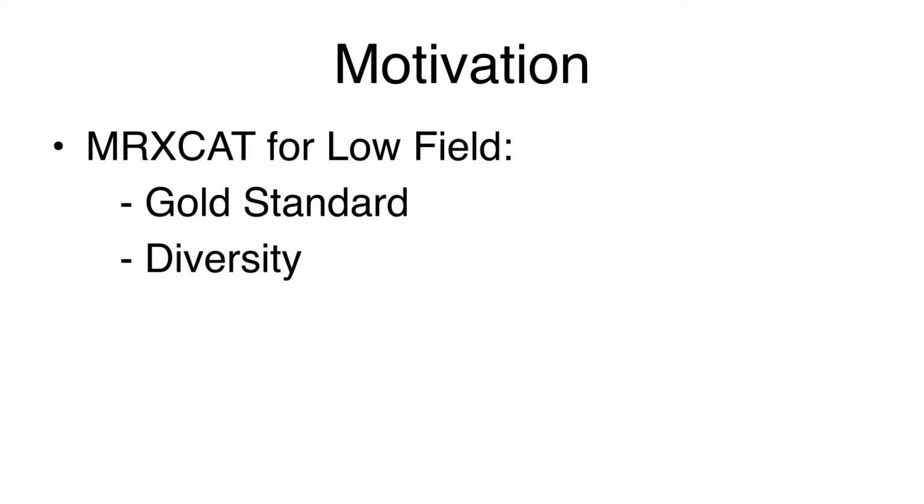So the reason behind using MRXCAT was that it basically provides a gold standard. It also provides diversity: you can simulate systole, diastole, or you can change the body weights or different anatomies. So it is quite diverse in its applications.